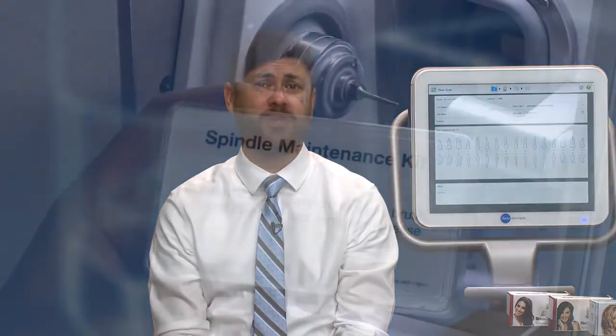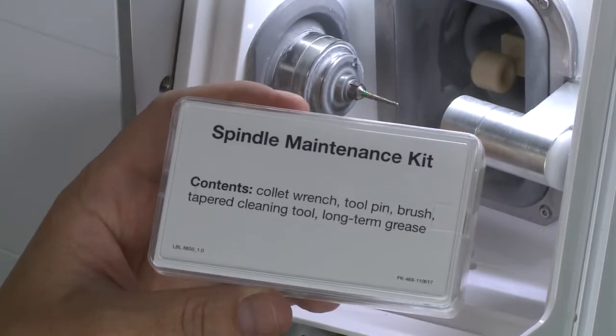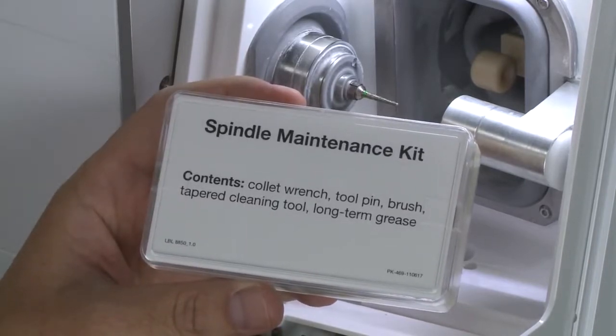It is important to mention here that the mill system comes with a spindle maintenance kit. It is provided when you purchase your Glidewell.io in-office solution. Using the spindle maintenance kit to clean the spindle collet on a monthly basis ensures efficiency of the mill system.